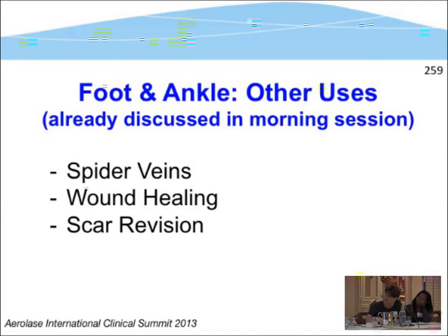So I started using the Neo and multiple treatments right through the wound I went. I did it on low settings because this does hurt. So if you think that a power mode of 3 doesn't hurt, on this, it hurts. So I listen to my patients, and I do multiple passes. I do about 2 or 3 passes to get through it. I treat the whole area around.